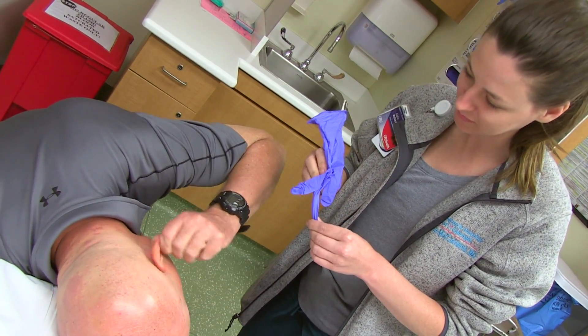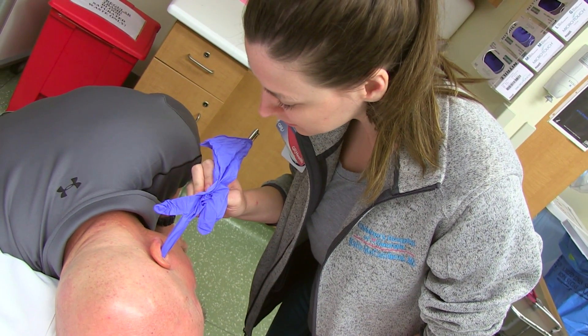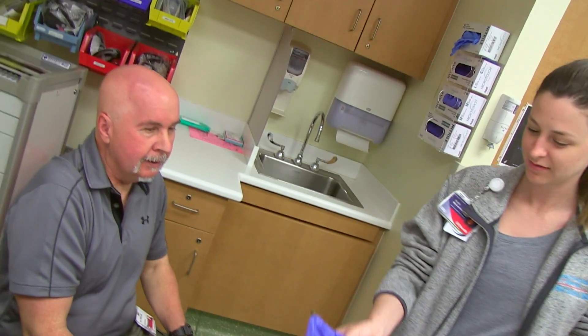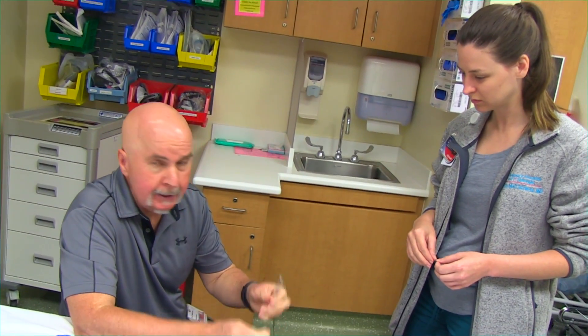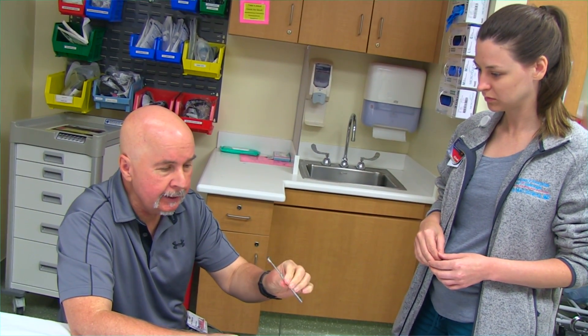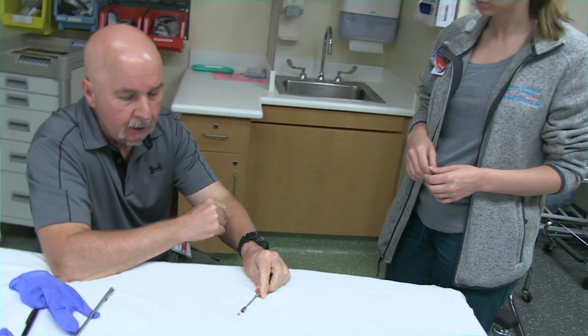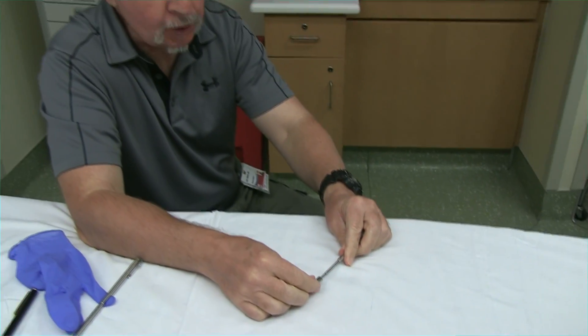Is it going to work pretty good? I think so. Here we go again. I heard it snap. Got it? Okay, good. Interestingly, this does not get deep into my ear — it gets halfway — but because of the beauty of these strong magnets, you just have to get close to the battery or the metal object and it attracts it.